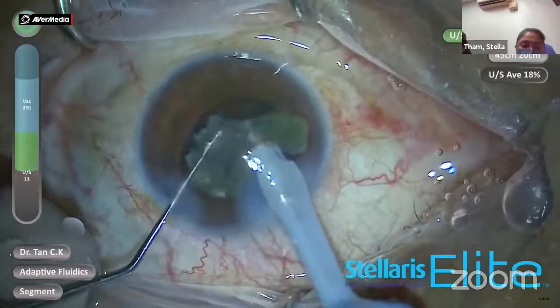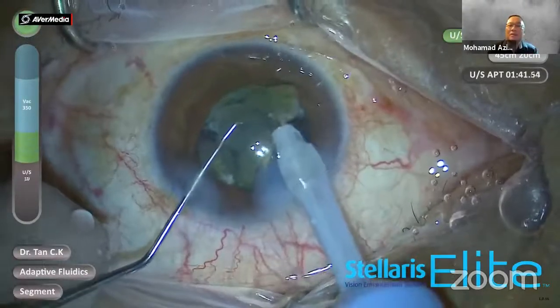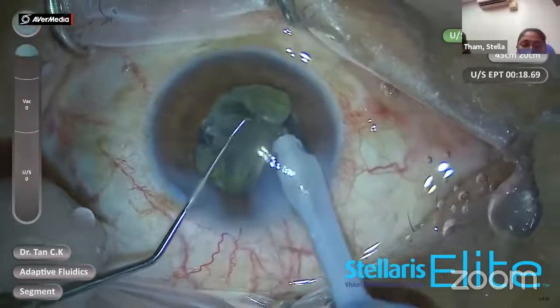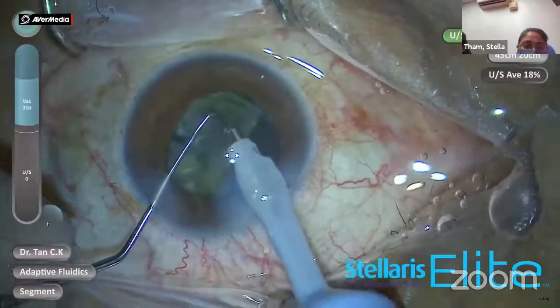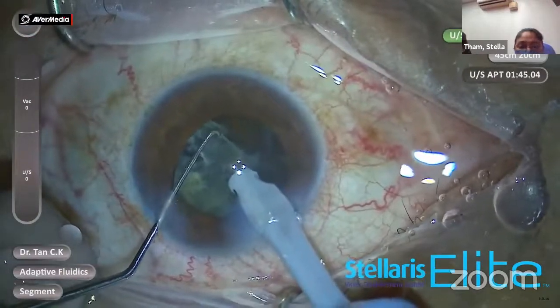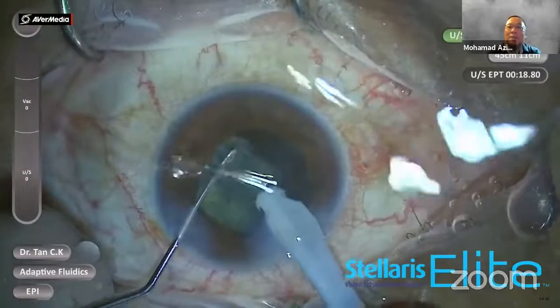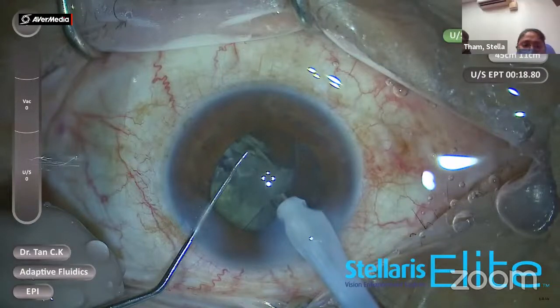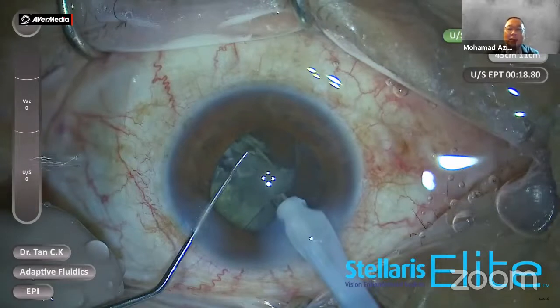What's the difference, Stella, in terms of the parameters? What's changed from the earlier one? Since it's a bit difficult to remove, and it's already a thin nucleus, we changed to epinuclear setting. Stella, can you stop for a while? What is changed, the parameters, from the high setting to lower setting? The water height? Water height maintained. What is changed then? Ultrasound. Vacuum 50 to 200. You go back to your high setting, the earlier one.